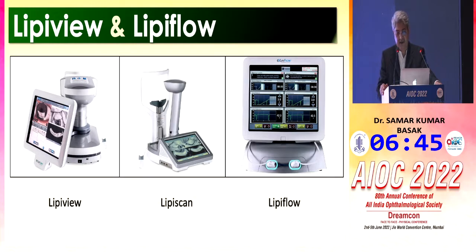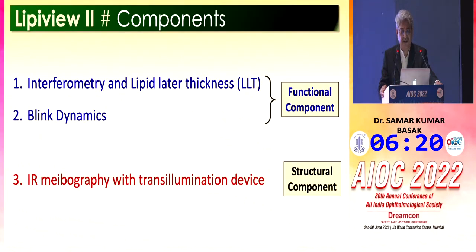So coming to the LipiView and LipiFlow: LipiView, LipiScan. LipiScan was the earlier version, and LipiView 2 is now the current version, and LipiFlow is their treatment section. So LipiView and LipiFlow were initially from TearScience, now Johnson & Johnson. I have no financial interest.